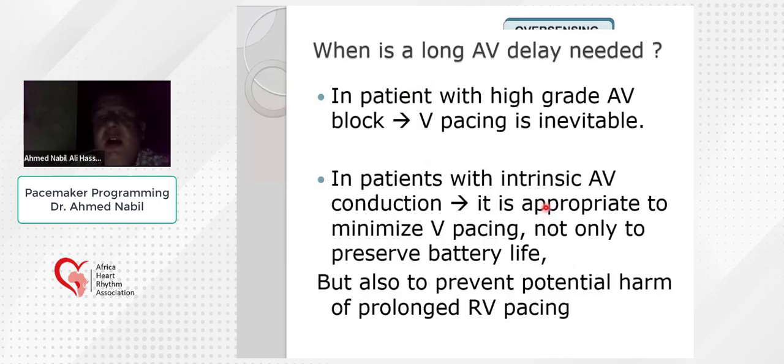Well, in a patient with a high grade AV block in which there is no AV conduction, there is no big deal in prolonging or shortening the AV delay, because in both situations the ventricle will be paced. But a long AV delay is important in a patient with intrinsic AV conduction, because if I have a chance that the intrinsic conduction or the normal conduction can take its way to the ventricle and capture the ventricle, it is very beneficial for the patient.